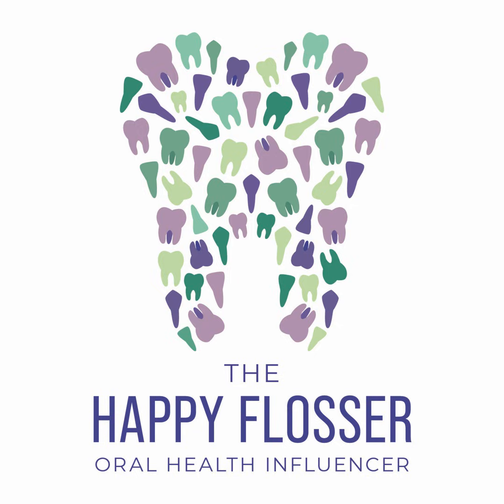Now, with that being said, sometimes when all of the premolars are present and all of the molars are present, you may need to take three bite wings on each side if you are doing horizontal or vertical in order to achieve this goal, capturing the distal of the last molar and the distal of the canines. So keep that in mind when you go to take your posterior x-ray. If you do not capture the distal aspect of the very last tooth, you may need to take a third one on that side, especially if there's a wisdom tooth present.